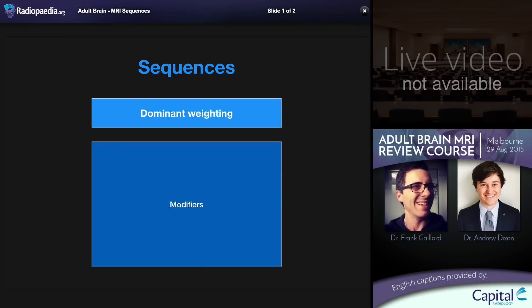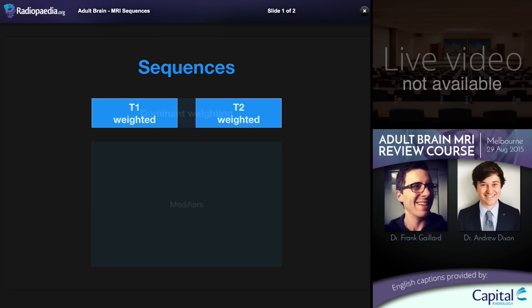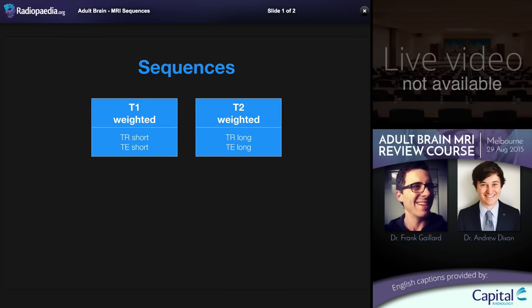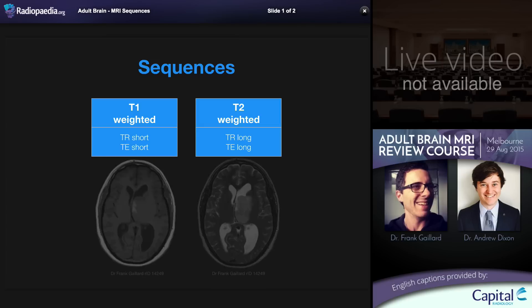When we talk about sequences, there's no single way of grouping them or of discussing them. But a useful one is to think about what the dominant weighting or dominant characteristic is being examined, and then there are a number of modifiers applied to each of these. Let's start with the main two that we're used to thinking about: T1 weighted and T2 weighted. These are the two fundamental anatomical sequences upon which many other sequences are built. They are characterized by specific TR and TE intervals, with T1 being short-short and T2 being long-long.